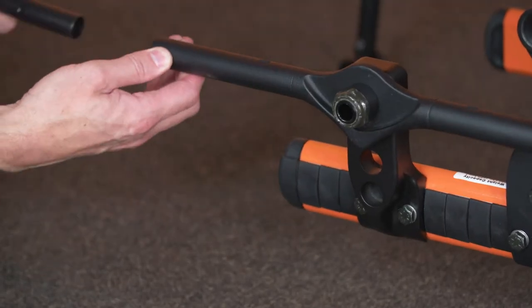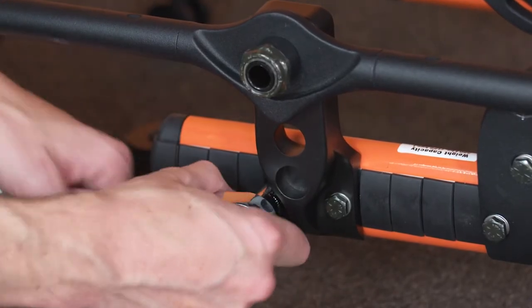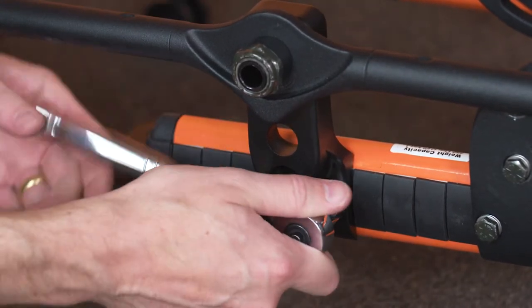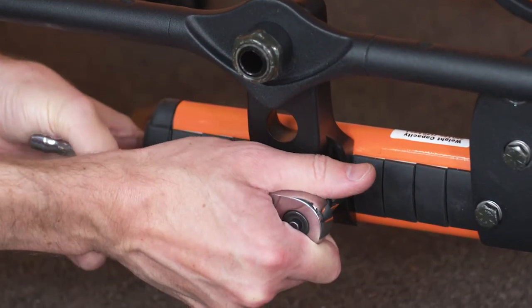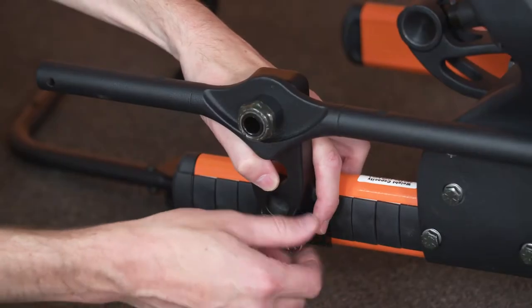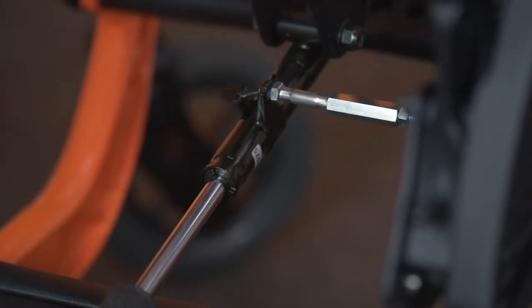Remove the anti-tippers and axle plate assembly to improve access to the crossbar mounting fasteners. Reposition the upper frame of the wheelchair to improve access to the rear upper frame crossbar.